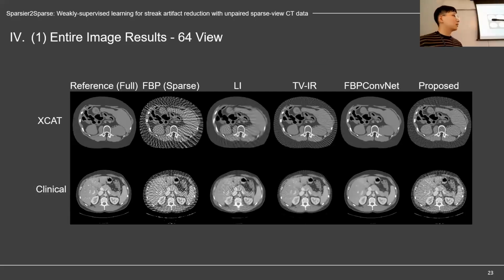So you compared different methods. Yes. A couple of questions. Each method involves parameters. So how do you select the parameters for each method to compare? For TV-based methods, we set the parameters to have the lowest MSE scores, such as the lambda. Okay. For example, you mentioned TVIR. That's not kind of an image you probably see in some of the papers in the literature; you don't see that kind of artifacts.